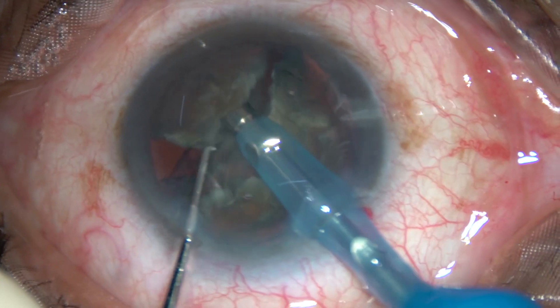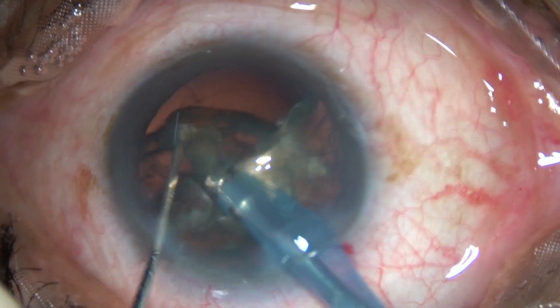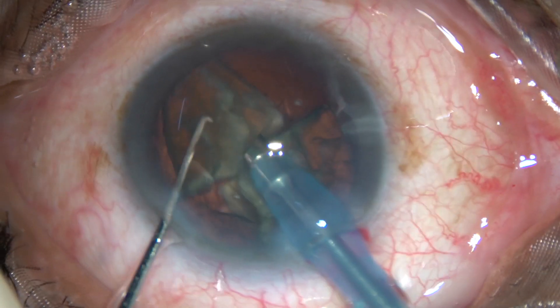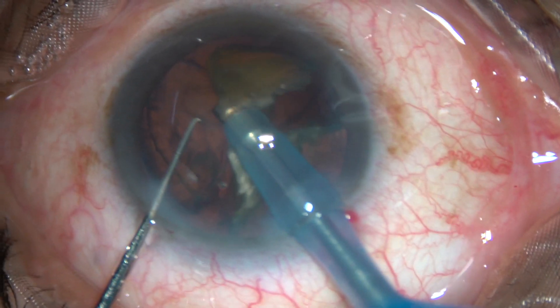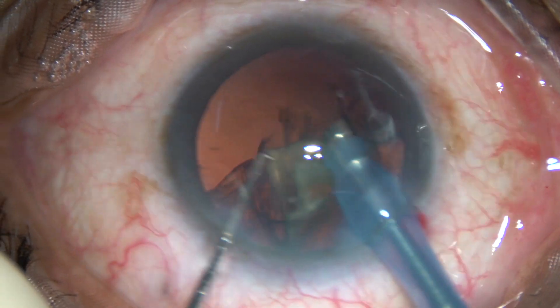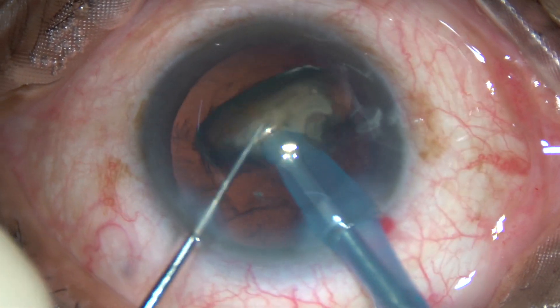Ultrasonic energy is employed to emulsify these nuclear fragments and they are removed from the eye. Ultrasonic energy used in this case is 75%, flow rate is 45 ml per minute, vacuum is 450 mmHg. This is the last piece, the last portion of the nucleus.